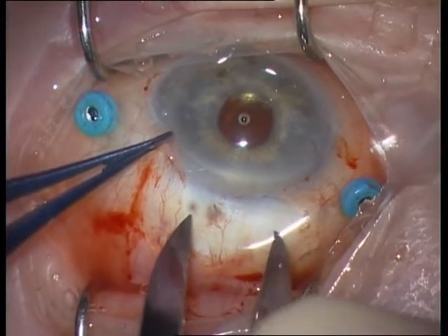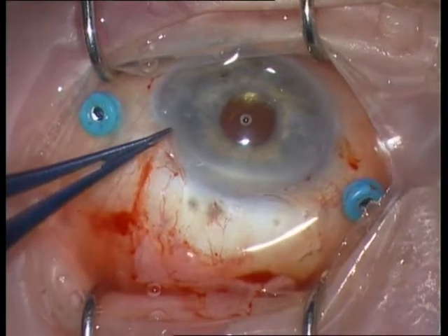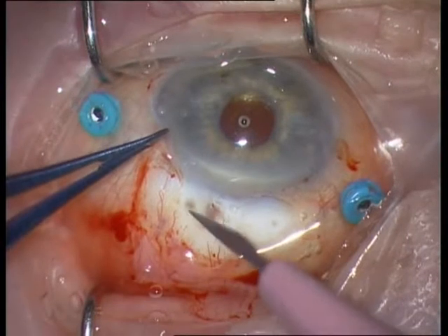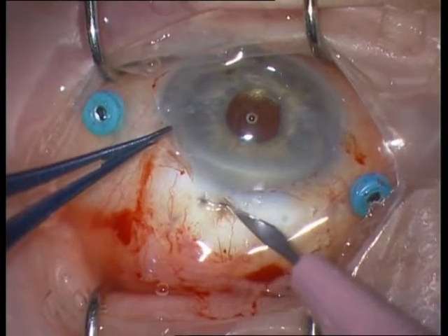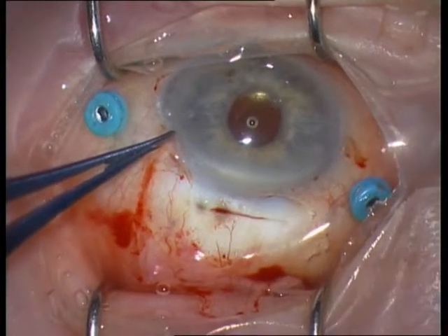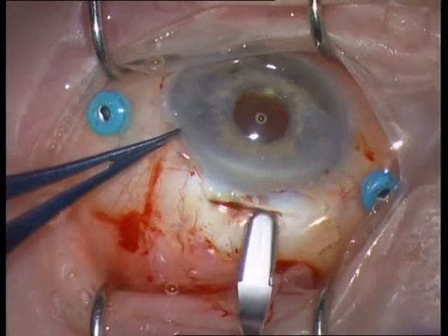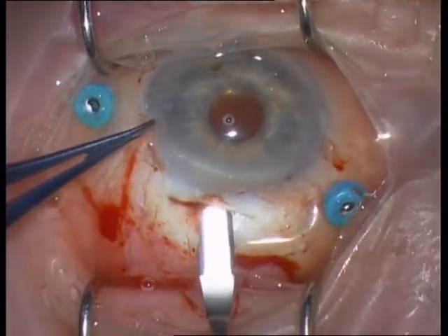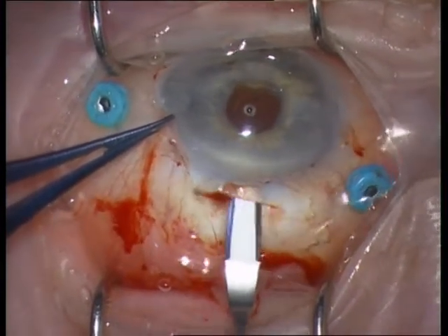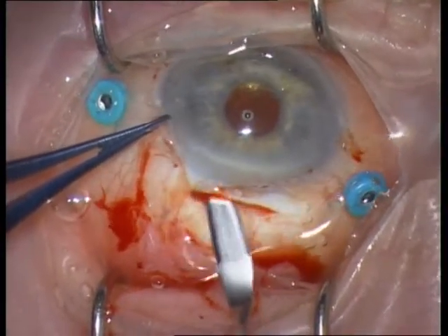Take the caliper and mark 6 mm on the sclera. This incision can be parallel or smiley. Take a 15-degree knife and make an incision which is 6 mm wide. Then dissect the scleral tissue with a crescent bevel-up knife.